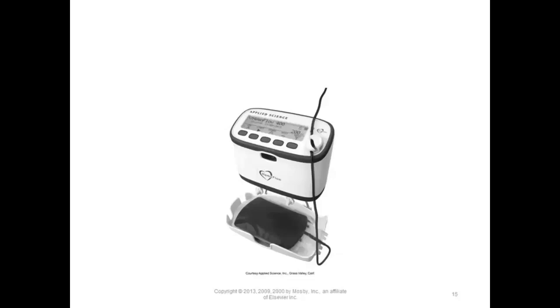Just like we would do our tubes, this is what they would do, constantly mix the bag to make sure no clots are formed. Because if you have a clot form in the bag, that would have to be discarded because there's no way you could give that to a patient. You wouldn't even be able to transfuse it because a clot would clog up that tubing. It wouldn't be able to go through.